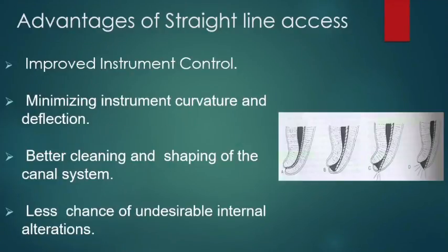All right, now what are the advantages of straight line access? First of all, improved instrument control. Number 2, minimizing instrument curvature and deflection. Number 3, better cleaning and shaping of the canal system. And lastly, less chance of undesirable internal alterations.